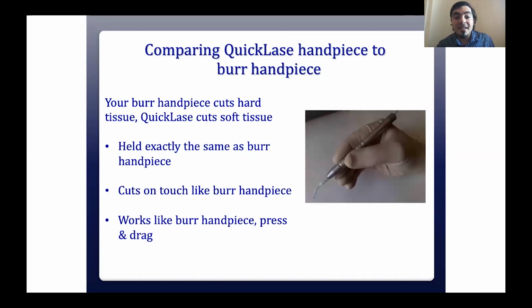And so just to finalize, one of the things I always say is that we are so used to having our hard tissue handpiece, our fast handpieces that are available to us every single day. But it's always worth noting that the additional soft tissue handpiece, which is a soft tissue diode laser, is so useful to add to your armamentarium and use on a daily basis, because you'll be surprised at the number of procedures it speeds up.